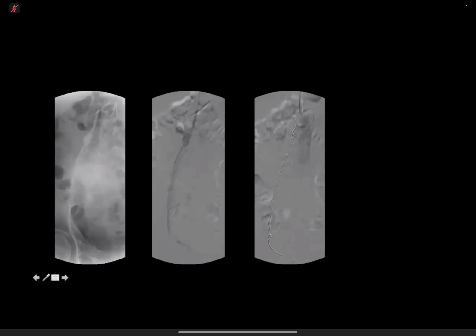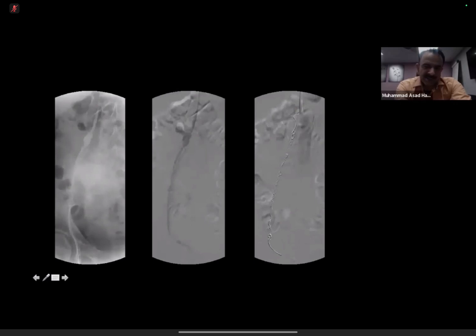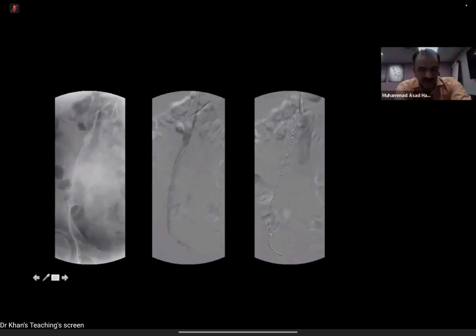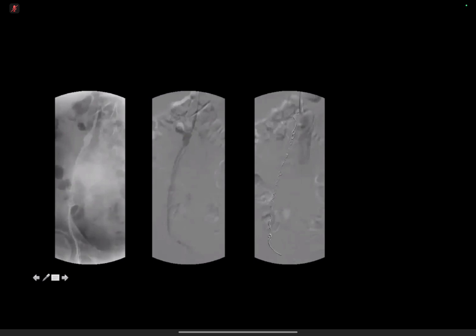Okay. Once the examiner shows you such images, they can also ask you about the venous anatomy, i.e. testicular or spermatic venous anatomy. So where does the right spermatic vein drain into the IVC? It's usually just below the right renal vein. And where does the left one drain? Left one into the left renal vein.